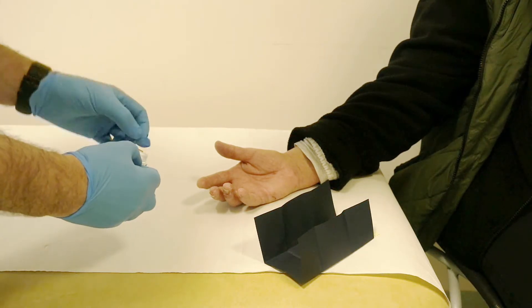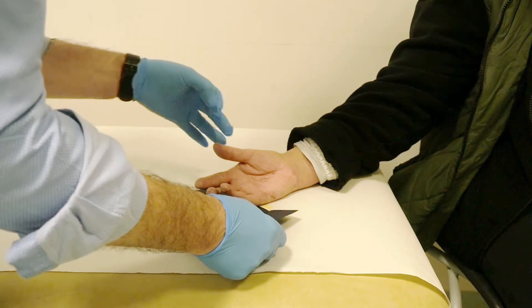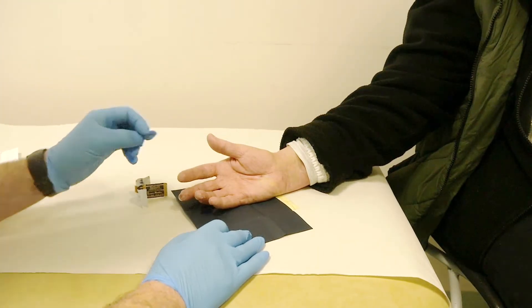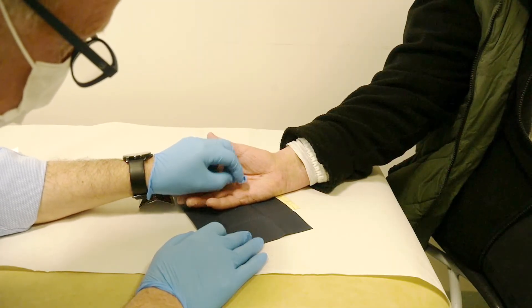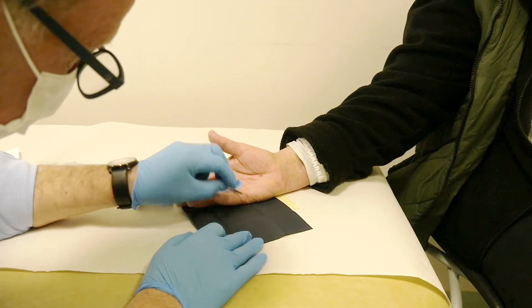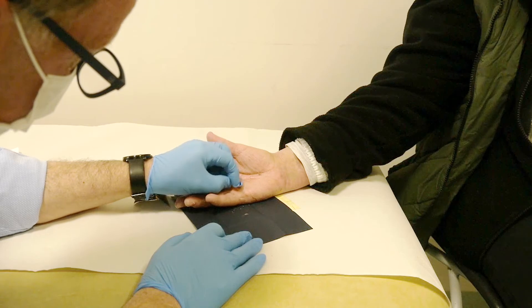For most areas of the skin, scale can be removed ideally from the active edge of a suspect infection using a clean sharp blade. Because it's easily available, a number 15 scalpel blade is usually used, but surgical sharpness is not necessary and any clinically clean blade will suffice. Gently scraping the edge of the lesion produces scale which can then be transferred onto a piece of paper and sent to the laboratory.